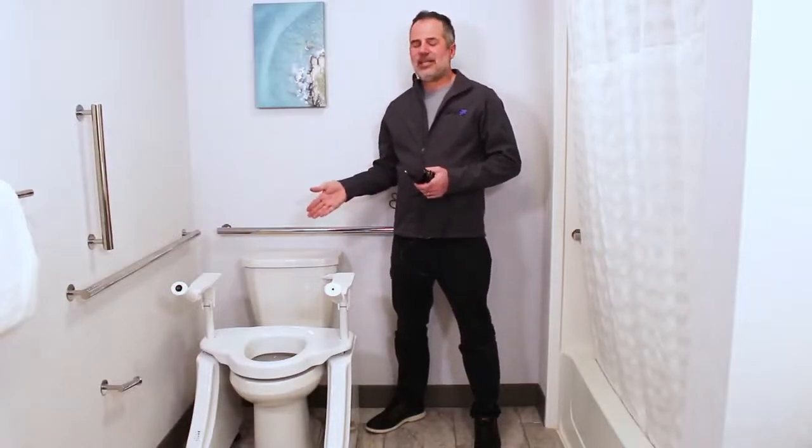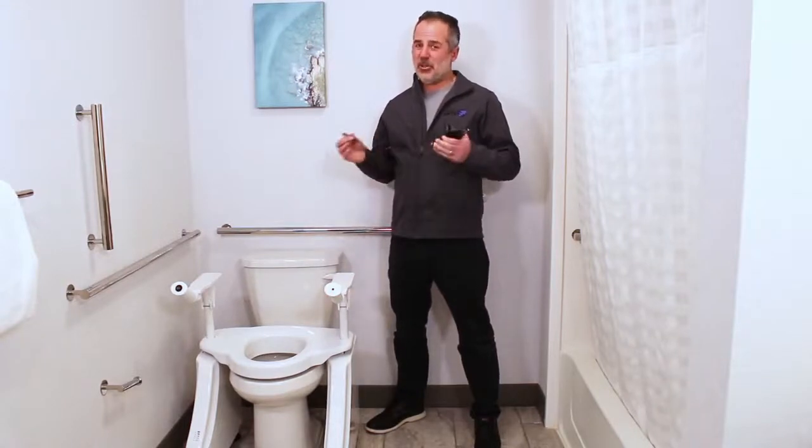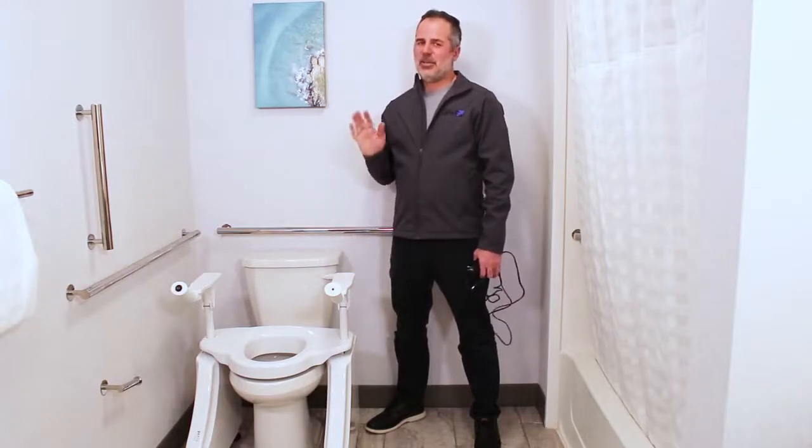Hi, I'm Tom from DignityLifts.com. This is the Deluxe Dignity Lift, the DL1, and it operates on both electrical power and a rechargeable battery. It's the best of both worlds, and here's why.